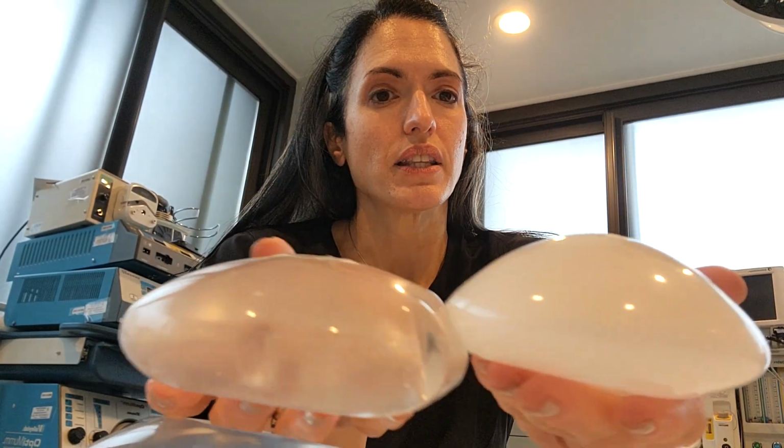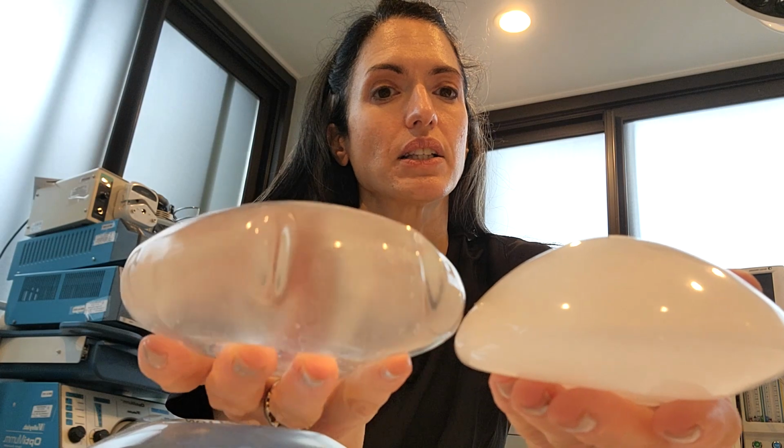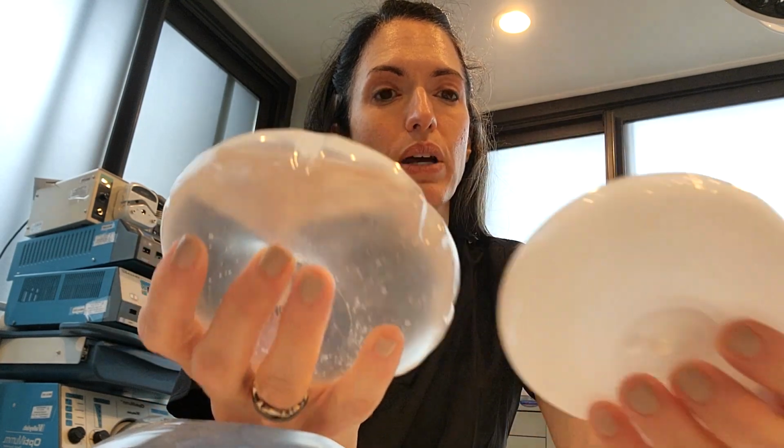And the difference with the ideal, this one doesn't have any fluid in it, just for me to show you, is you can see that there's multiple different layers. There's two different compartments. One compartment gets filled from the front, just like with a regular saline, and the other from the back. The difference in contour, which you can see, is that the ideal is going to be more like a dome shape, and the saline is a little bit flatter and a little bit rounder.